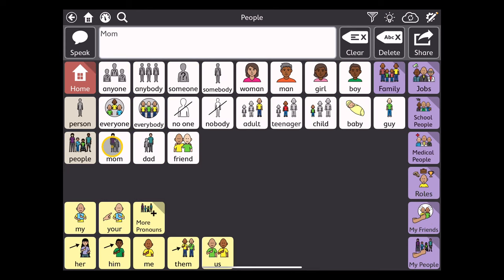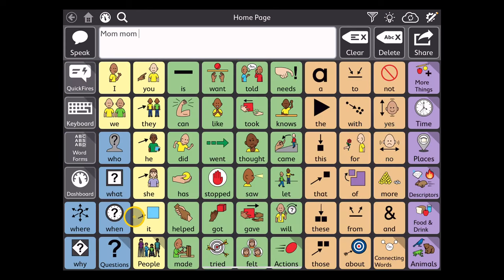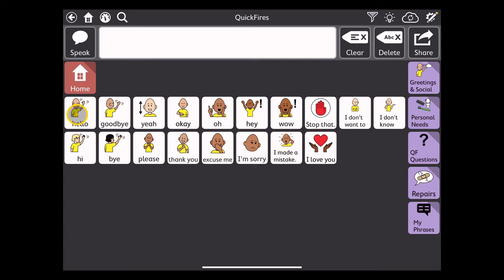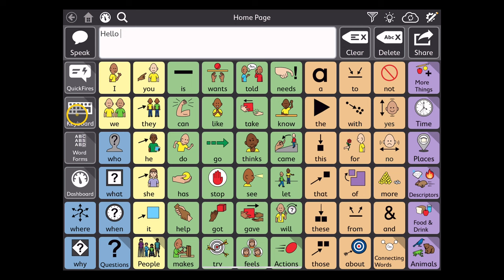I usually like to practice saying that word in the system. As I mentioned in TDSnap Core First, quick fires were an option, but quick fires would not send up to the message window. So if I wanted to combine a quick fire in the old system, nothing would go up into the message window. This is something it now does do, so I can hit 'hello' and know that it will go up to the message window.